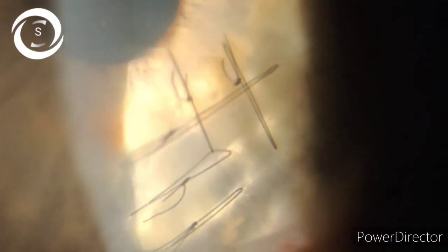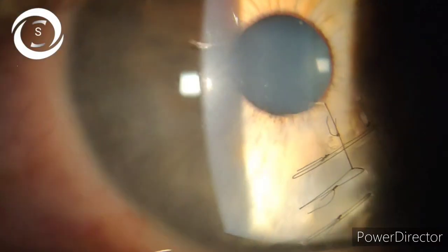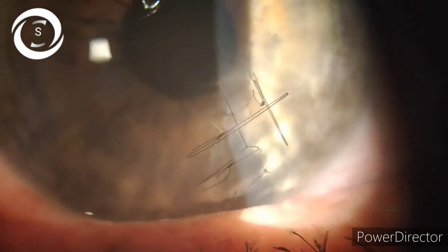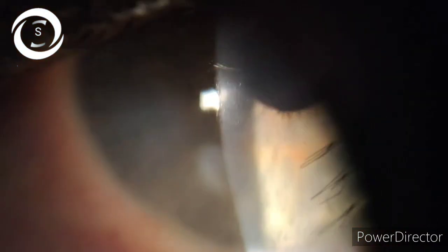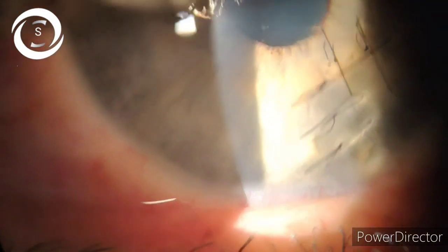The other good thing was that there was no traumatic cataract formation. I was expecting cataract because usually when the anterior chamber gets shallow and there is full thickness corneal tear, chances of cataract formation are increased.